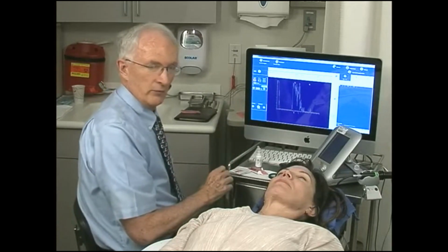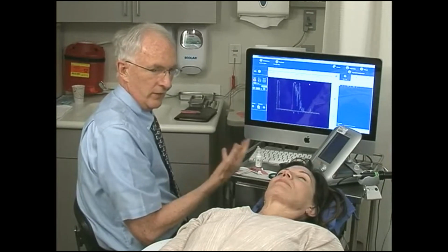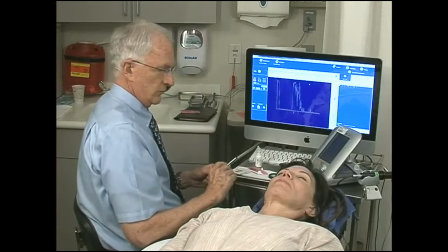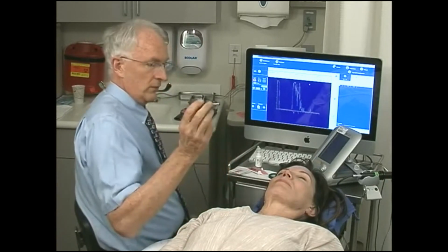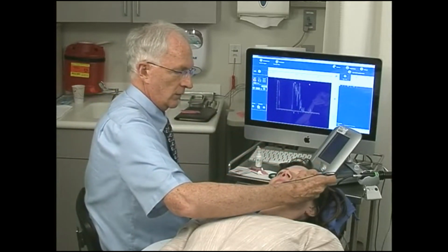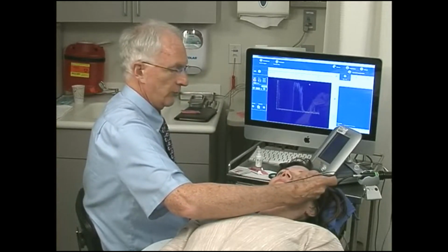There are various tables indicating muscle thickness in normal patients. I'd refer you to that. Also, the textbook addresses that. But we measure the superior rectus muscle in this situation. I then look at the medial rectus muscle by placing the probe on the lateral globe, aiming nasally towards the medial rectus muscle. I move the probe back and forth.